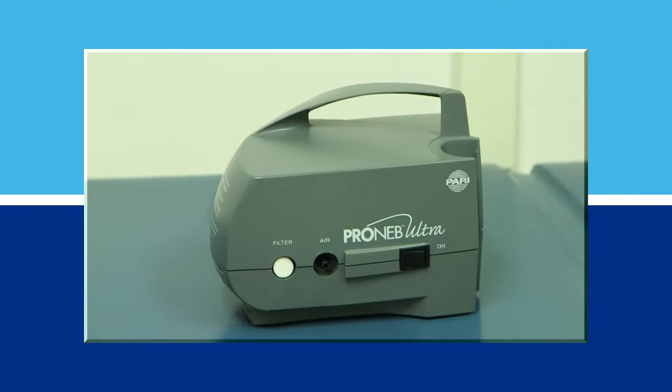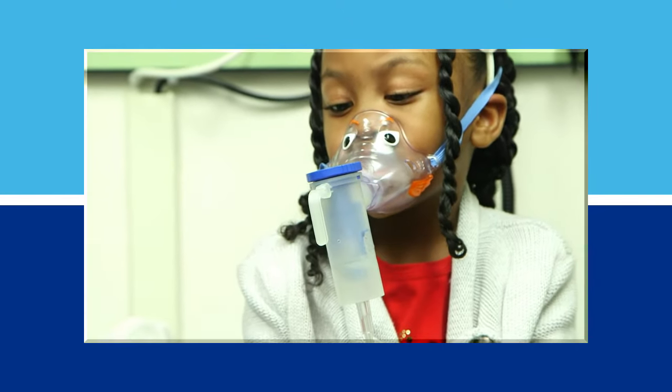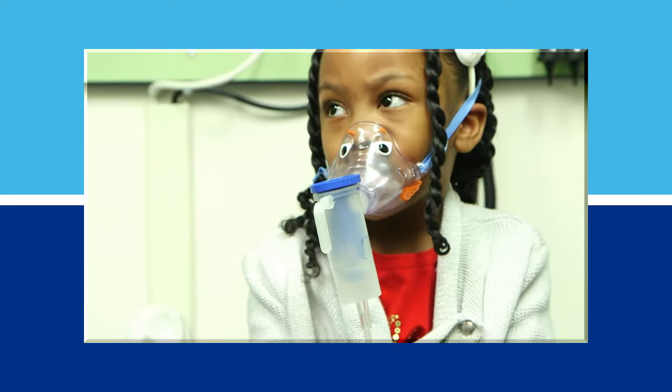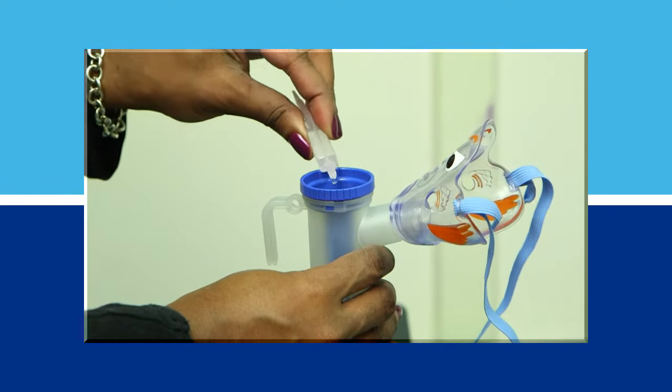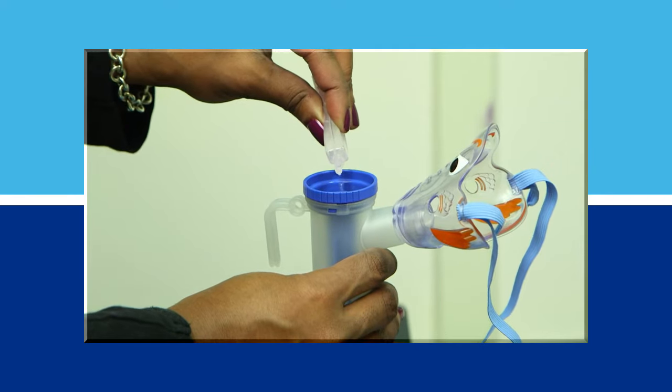A nebulizer uses a machine that makes a mist of medicine to breathe in through a face mask or mouthpiece. Your child's doctor or nurse will tell you how much medicine to put into the nebulizer.